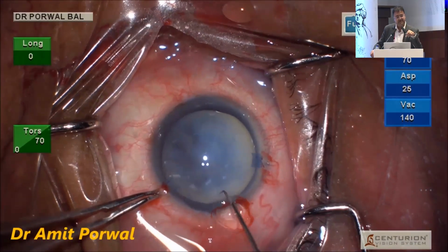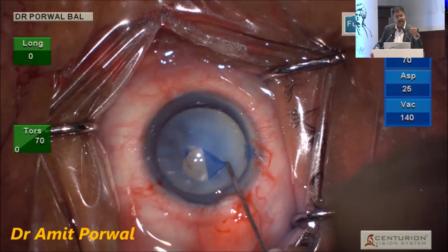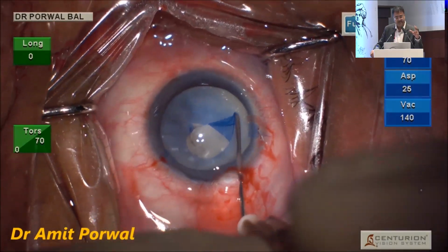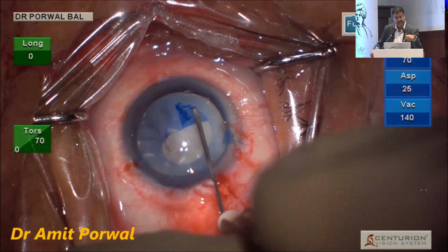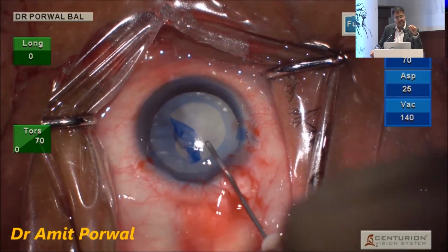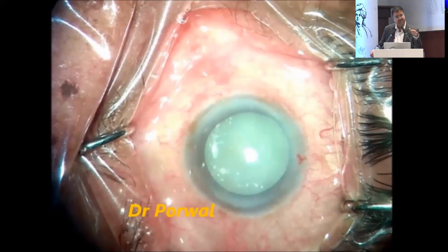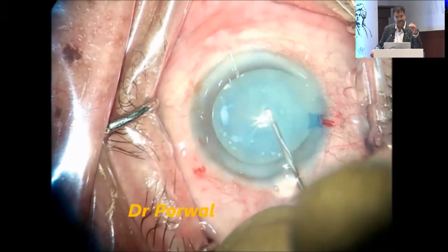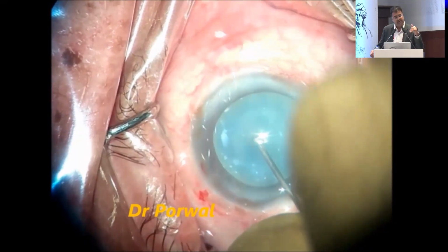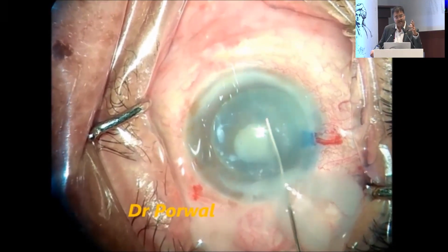So this rhexis marker you saw, I just put a rhexis marker on the cornea, which gives me a rough guide that my rhexis is going to be 5 millimeter. So you see, when I'm doing this, you can see on the anterior capsular flap some calcified spots are there. When you're doing the rhexis, make sure that you don't go over the calcified spots. If you go over the calcified spots, then you are going to extend the rhexis. Try to include or exclude the calcified spots. The first puncture, it's a Morgagnian cataract.